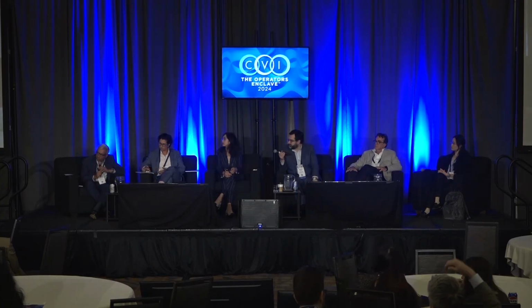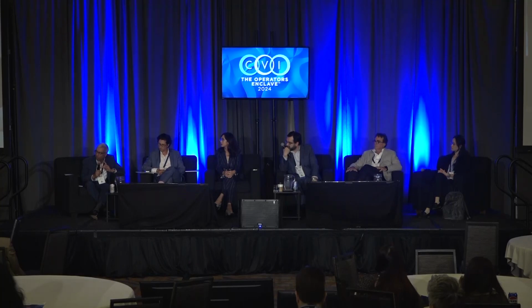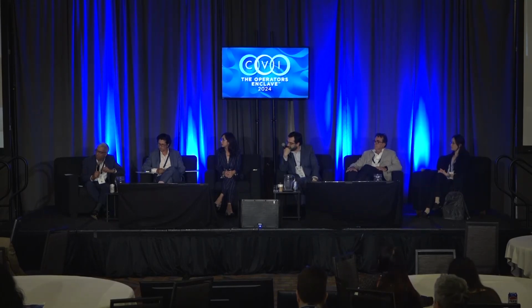Jason, just two questions. One, the trial design. Is it a non-inferiority design with a primary endpoint at 1 year for stroke and bleeding? Right, it's a clinical primary endpoint, stroke or systemic embolism. And then there's a secondary endpoint which involves bleeding. And the primary endpoint also involves safety. And then the secondary is residual leak, DRT, those types of things.